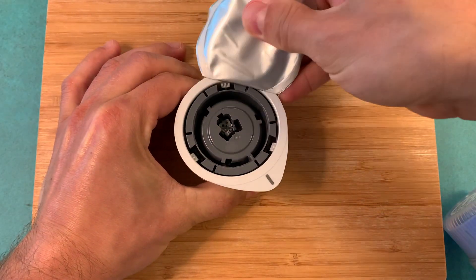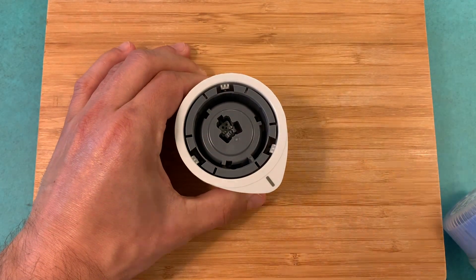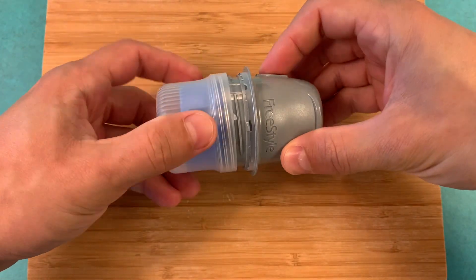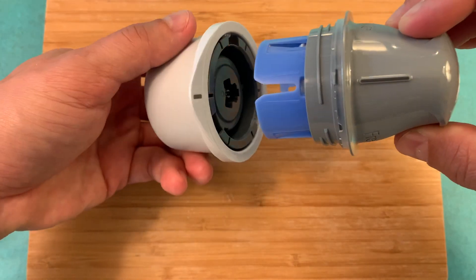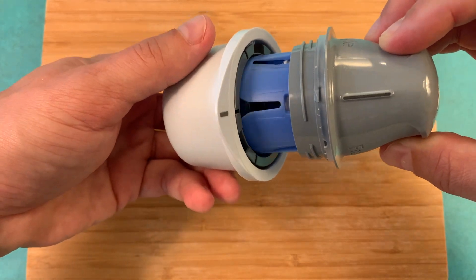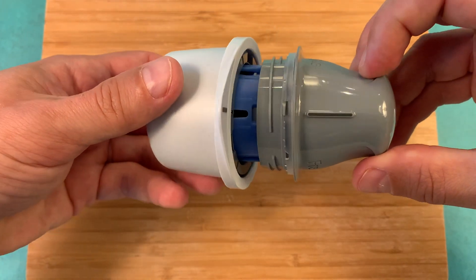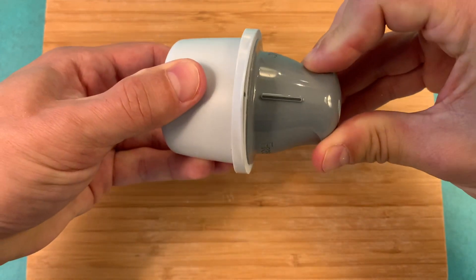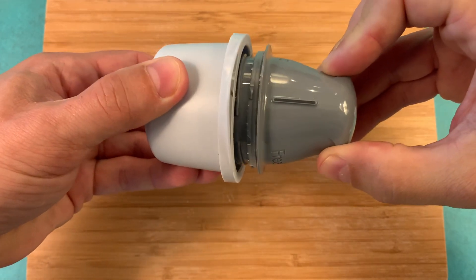While the skin is drying, peel the lid off the sensor pack and unscrew the cap from the sensor applicator. Next, place the sensor applicator into the sensor pack. You need to line up the mark on the applicator with the dark mark on the pack, and press down firmly until it comes to a stop and clicks. Then lift the applicator from the pack and it's ready for application.